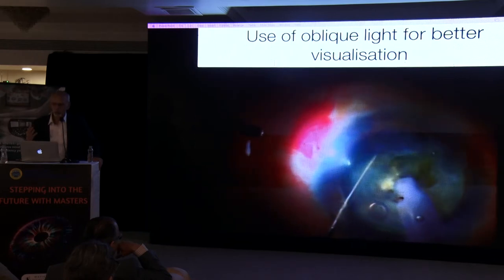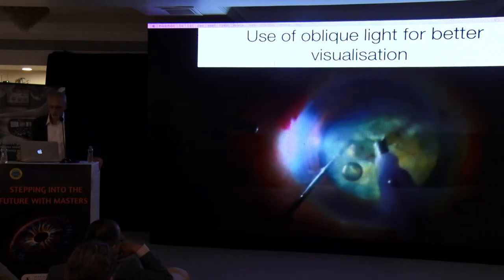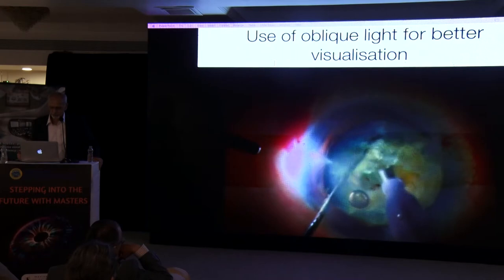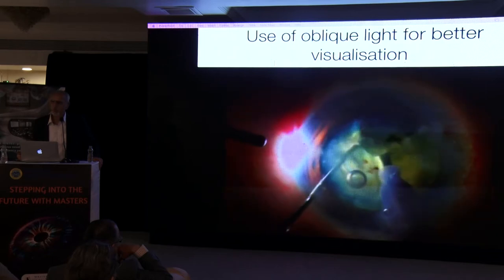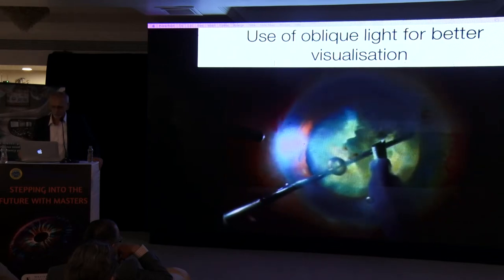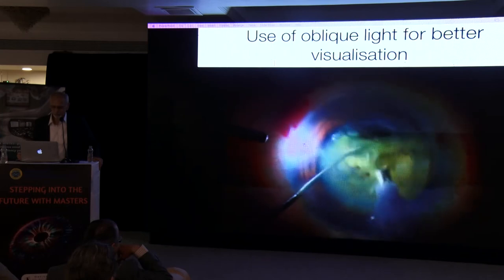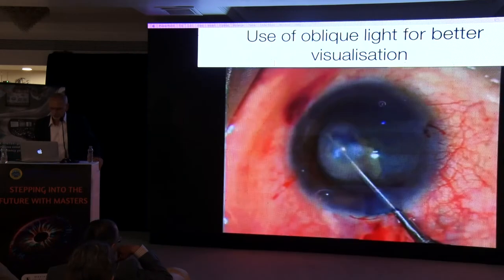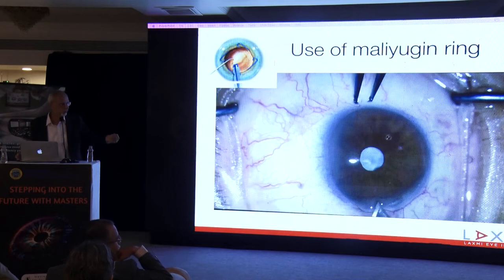because here you really don't want the glow. You want to work on your rhexis or your nucleus management, which you can very efficiently do if your light is properly directed. And once your assistant has a hang of where to hold it, which comes by trial and error, it's like walking in the garden, really enjoyable. Like some of you who have done scuba diving or snorkeling, you know the kind of look you get, you enjoy it. Just optics, like the fiber optic that you use here.